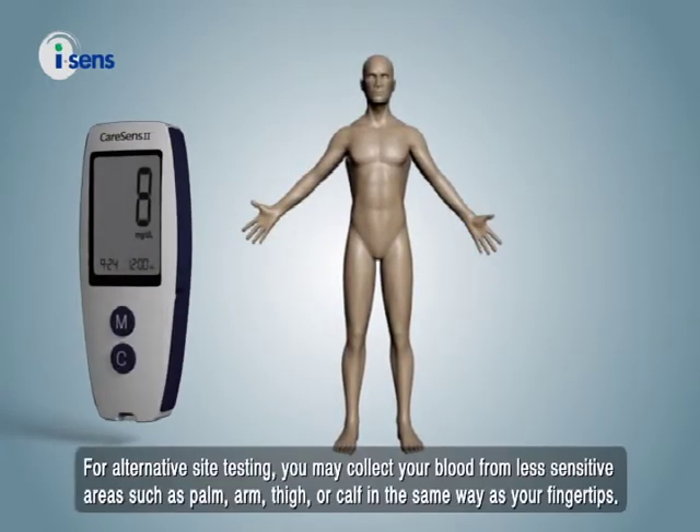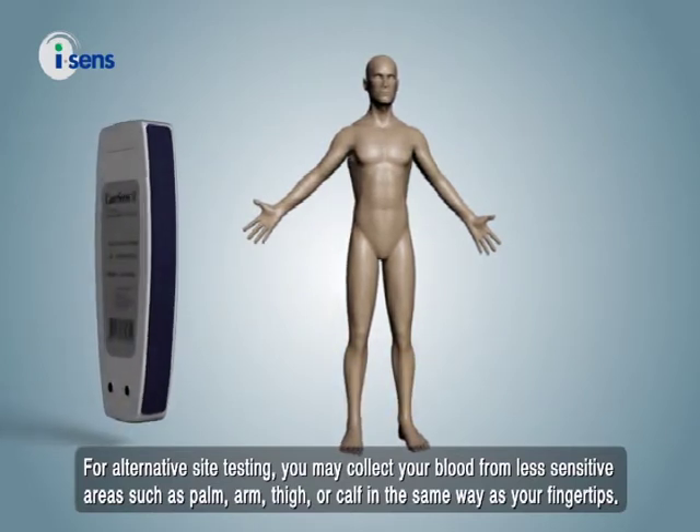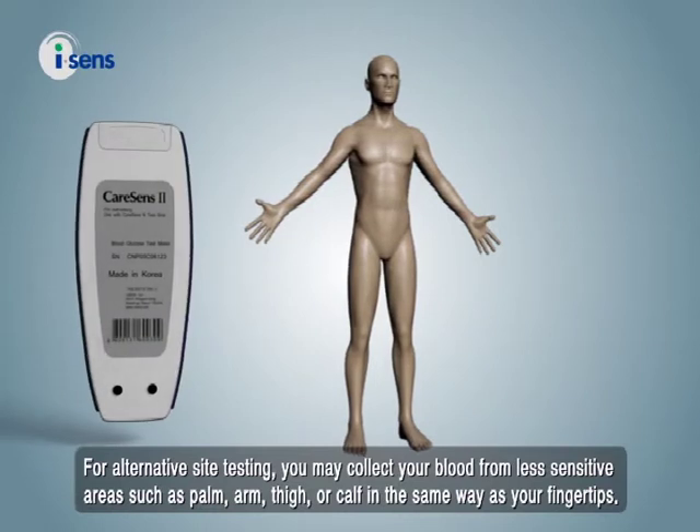For alternative site testing, you may collect your blood from less sensitive areas such as palm, arm, thigh, or calf, in the same way as your fingertips.